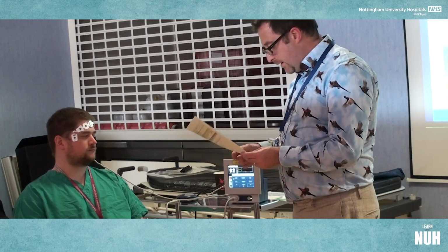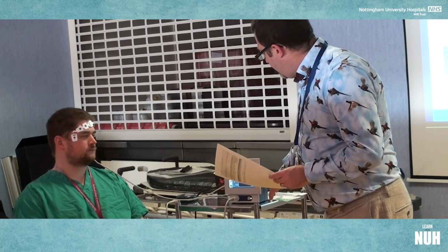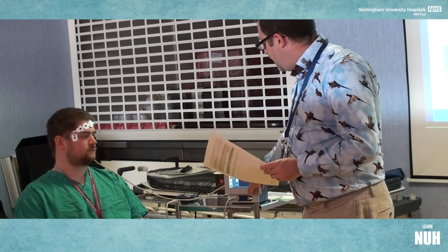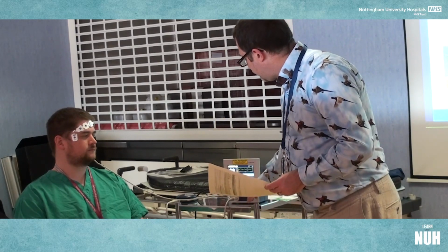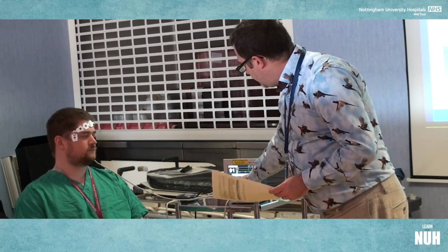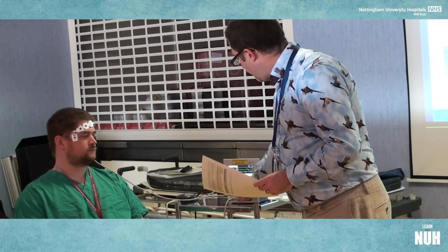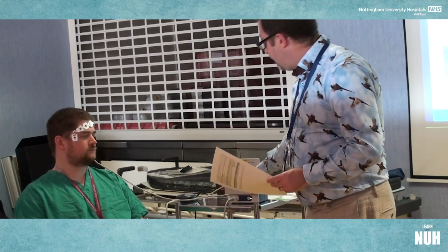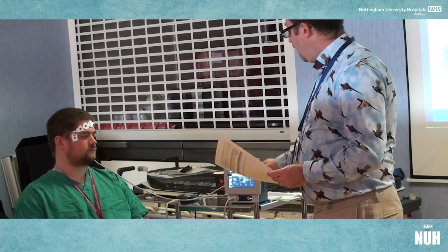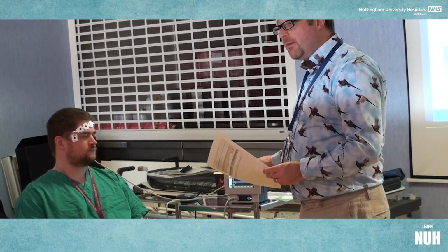The other thing that we might look at is the chart data. So if we look on the right hand side, we can see every 15, 10, 5 minutes what the time, what the BIS, what the EMG was, so you can chart that down. We can also look at alarm volume, so just here, we can change what sort of level we want the alarm. And then in relation to any settings that we change, we can press view save settings here and just press save active. So the next time you switch the BIS monitor on and off, it will come back with the same default settings. The other thing you can change is what's displayed in the bottom and top of the monitor.